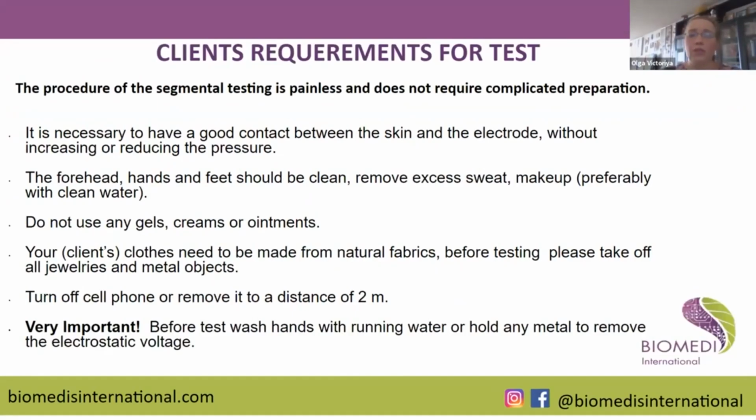The procedure of the segmental testing is painless, and it does not require any complicated preparation for the operator. So what is important? It is important to have a very good contact between the skin and electrodes for the device to work properly. Without increasing pressure, it just needs to be really tied up nicely. The forehead, hands and feet should be clean.